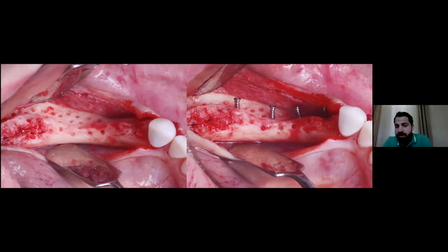What is the importance of the tenting poles? In cases of GBR, lateral ridge augmentation or vertical augmentation, the important thing is to support your bone, so you don't want any pressure over your bone. You can get that with titanium mesh, with Khoury plates, or with titanium-reinforced membranes, where this hard material will support the flap and reduce the pressure that you're having over your bone graft and your membrane.